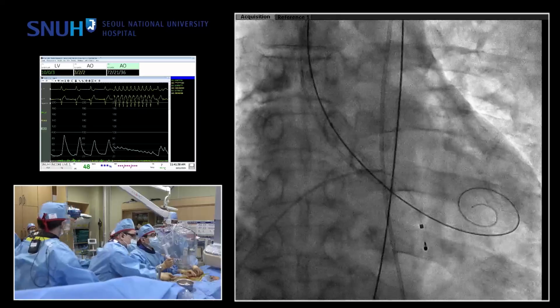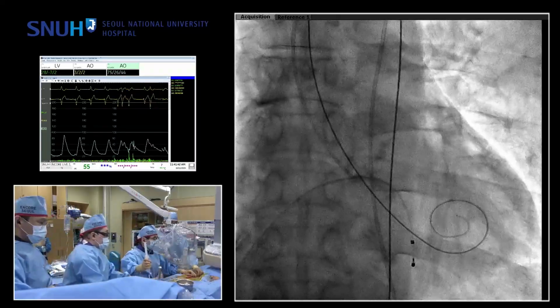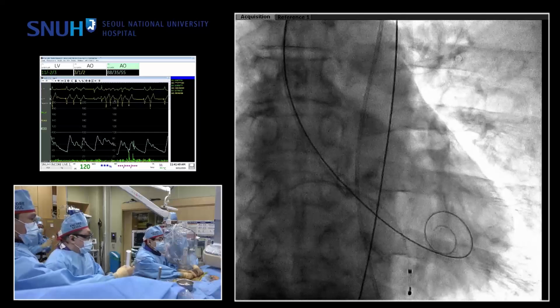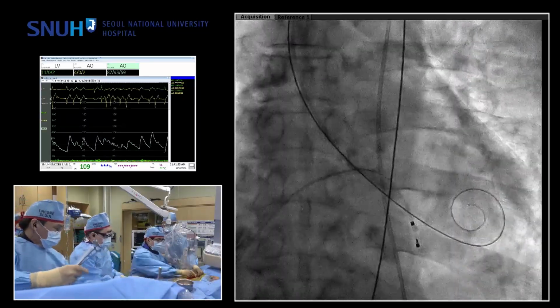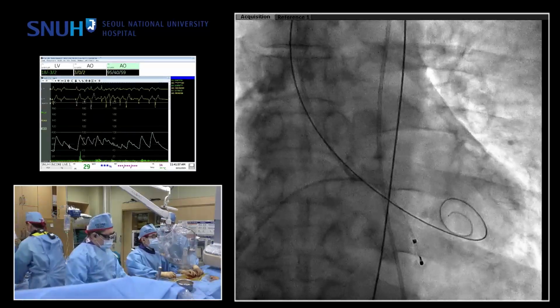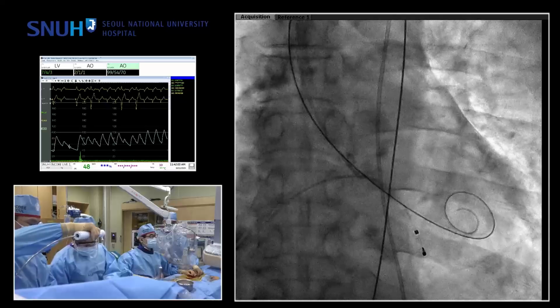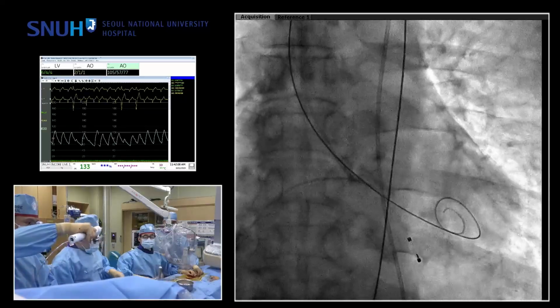Better. In your slide presentation, actually, this patient is a small size of annulus, but you compare the measurement in the four companies, and the Boston size of the annular size around 400. The other company measured it around 450. So, do you strongly believe that the 400 measured by Boston is sure?